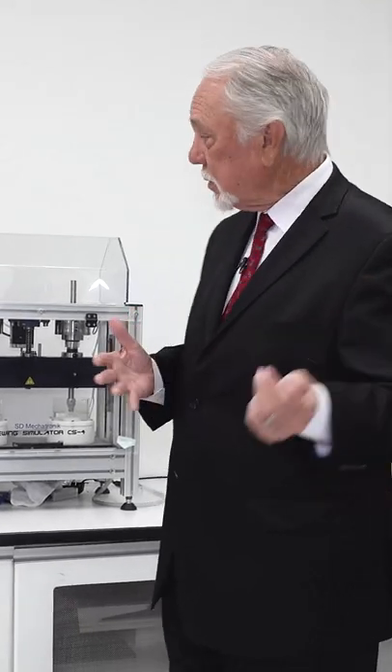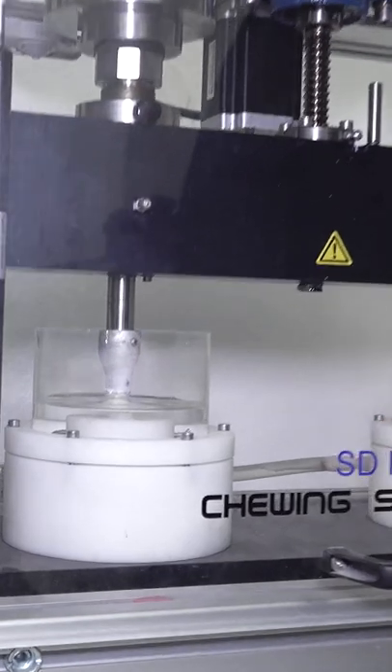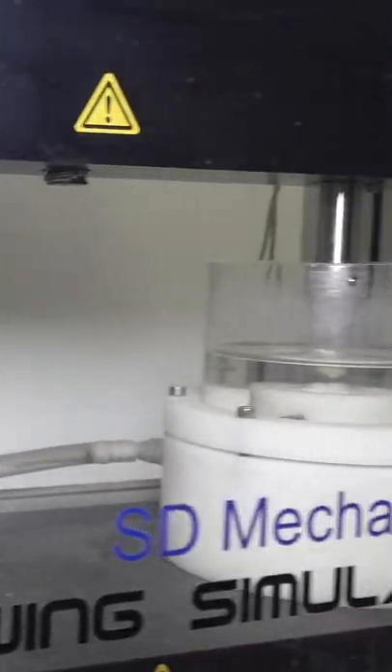So we bought some machines — these are Willitech machines. They'll do 1.2 million cycles of chewing. Unfortunately, it takes a little over three weeks to complete the chewing cycle before you know whether you've got the wear you want.